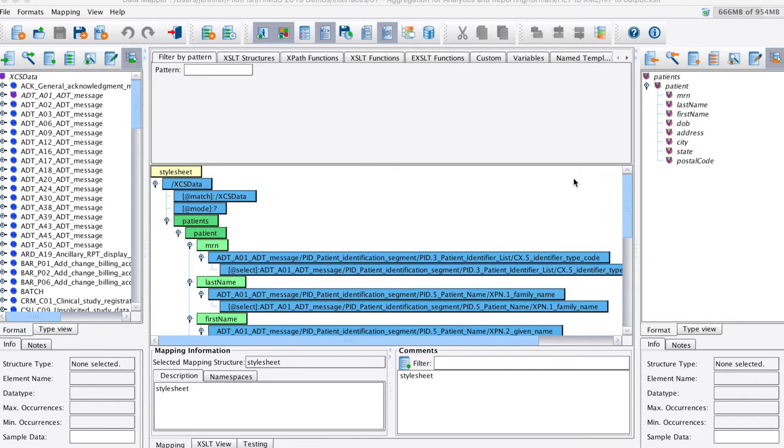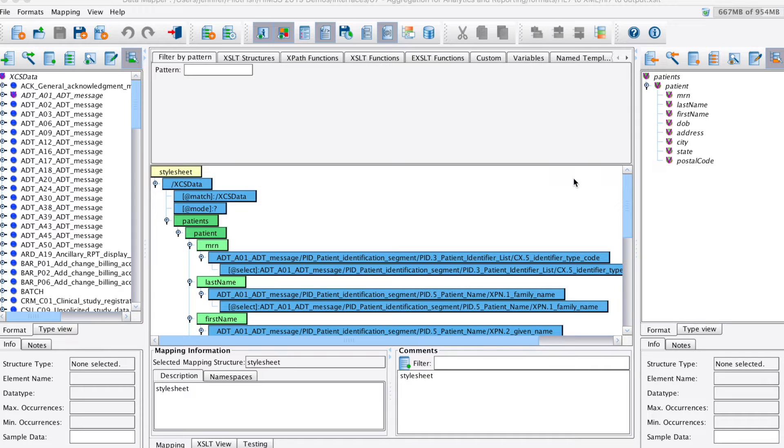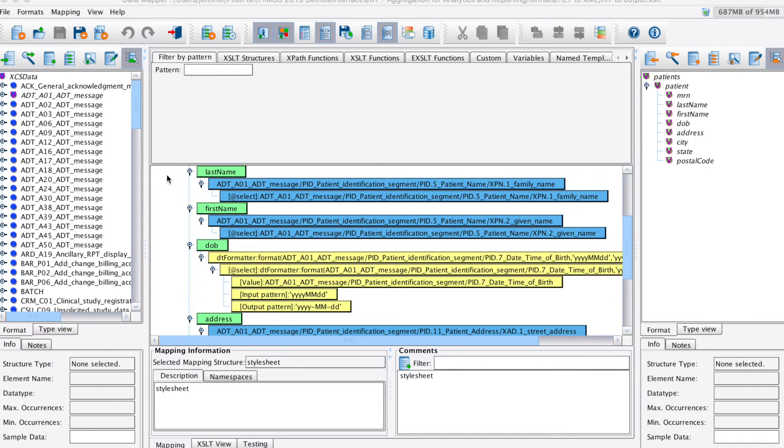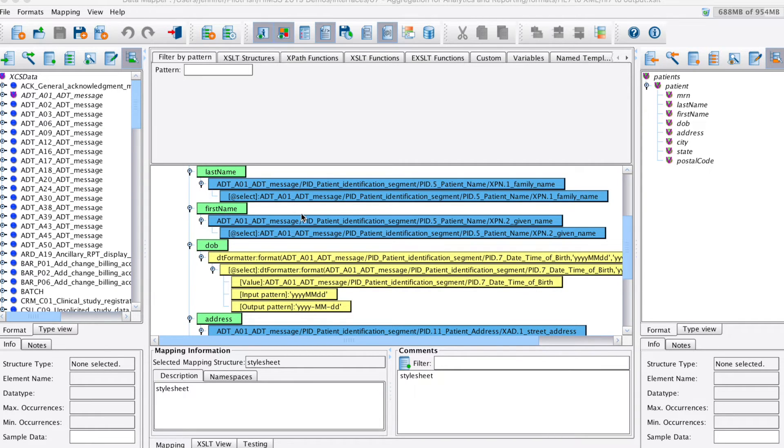Logical mapping rules are created through dragging and dropping onto the structure in the middle, with green nodes representing XML elements from our custom XML file, and our blue nodes representing values mapped to those fields. For instance, here we can see the patient information mapped into the person's last name, first name, and date of birth field.